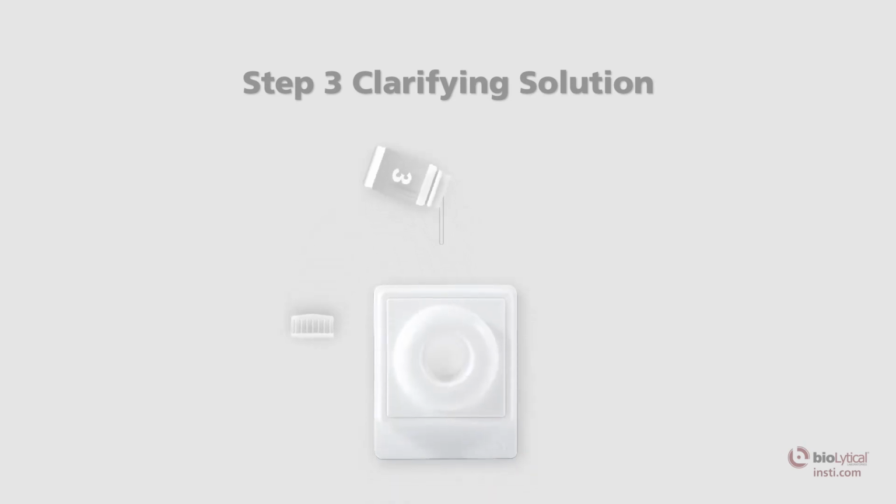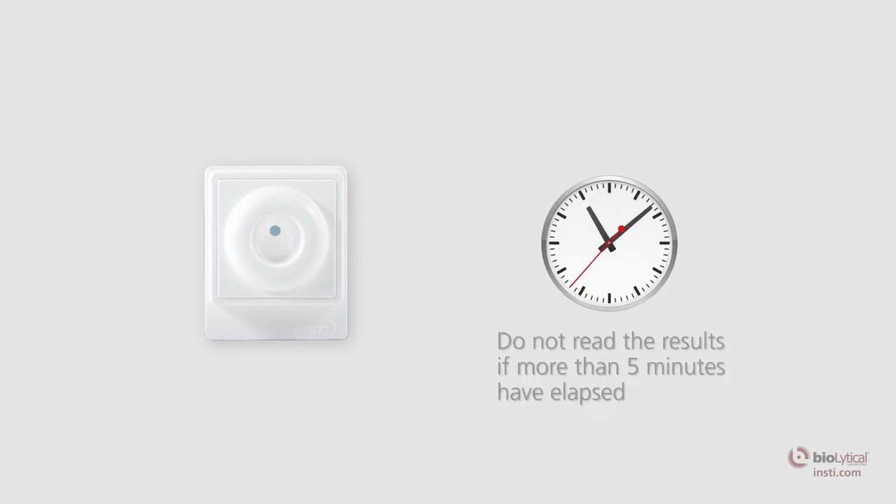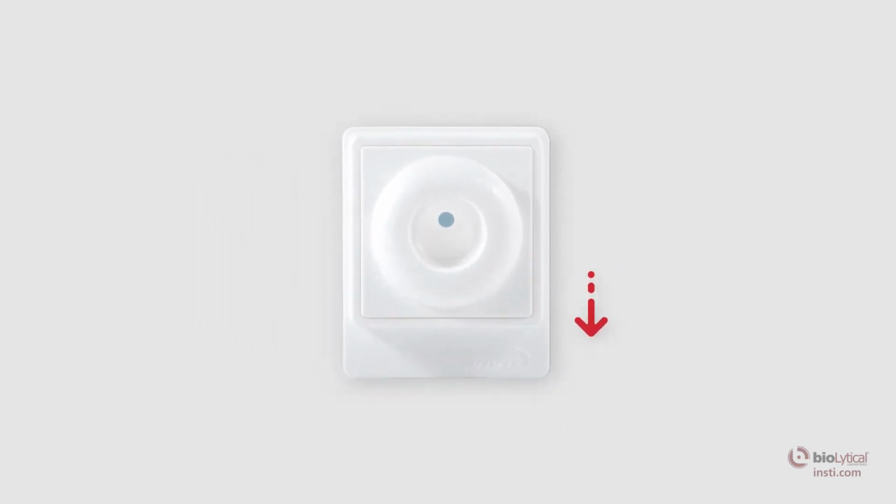Step number 3. Clarifying solution. Open bottle number 3, the clarifying solution, and pour the entire contents into the center of the membrane unit well. The solution should be absorbed completely. The clarifying solution will reduce the background to provide more contrast to the spots and facilitate reading. Immediately read the result while the membrane is still wet. Do not read the results if more than 5 minutes have elapsed following the addition of clarifying solution. When reading the results, make sure the tab of the membrane unit is oriented towards you.